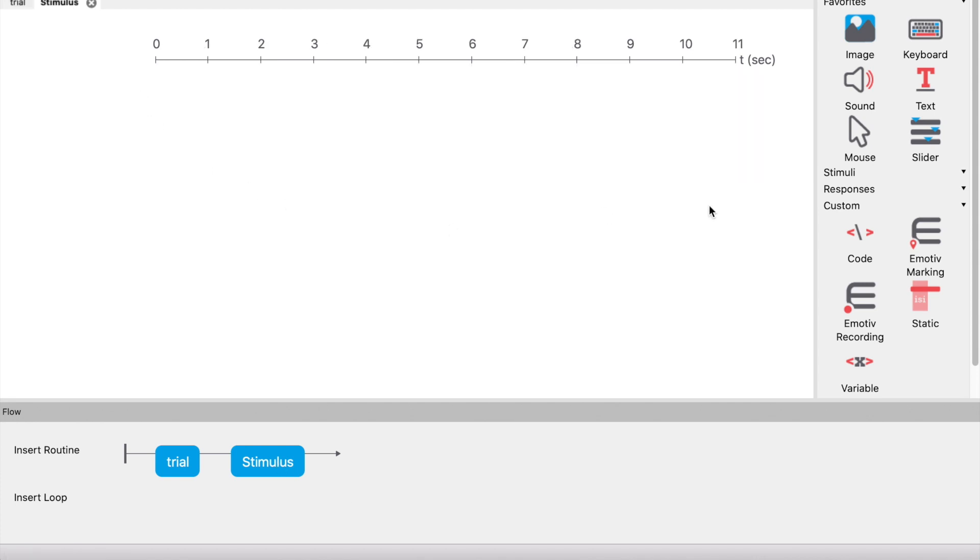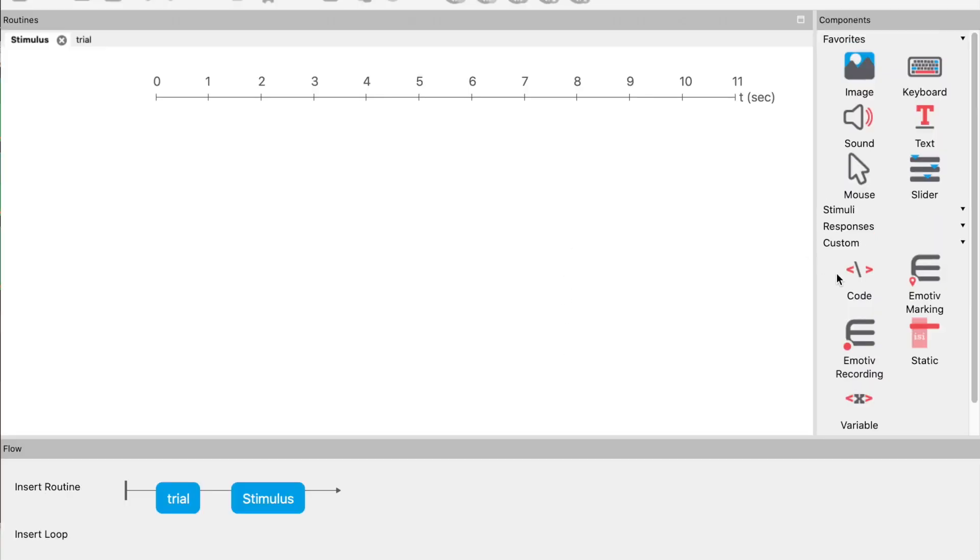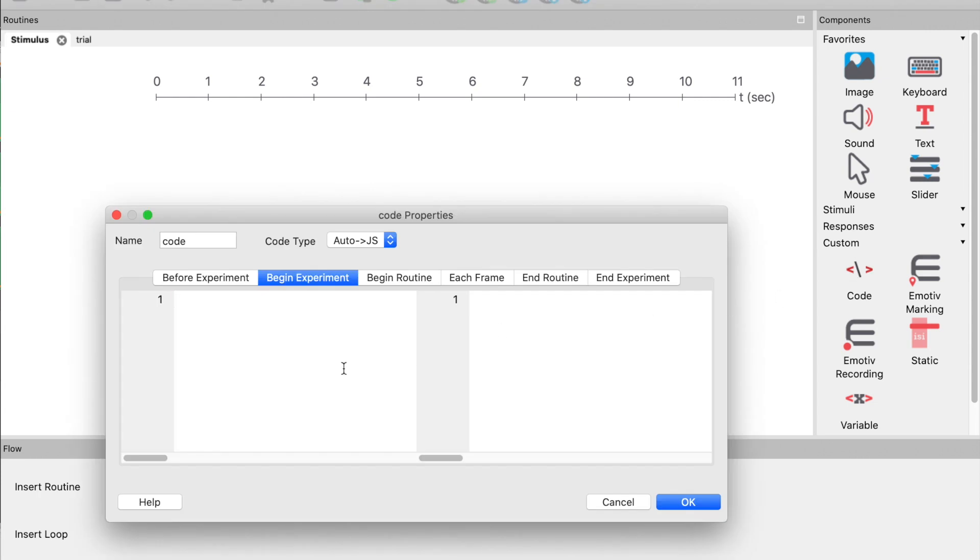PsychoPy allows you to present stimuli in many different ways. We are going to use a simple code component. We will use the code component to randomly select which tone to play and the length of the inter-tone time. Let's start by adding a code component and in the begin experiment tab, let's add a seed to the random number generator.